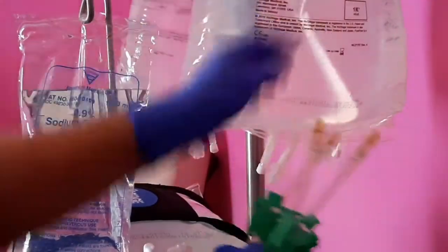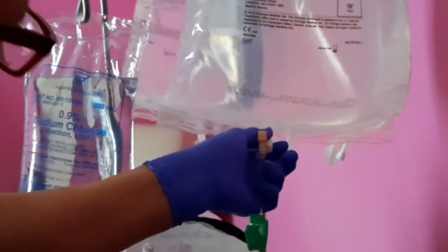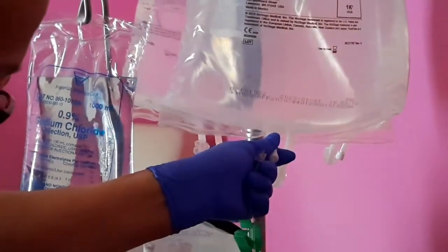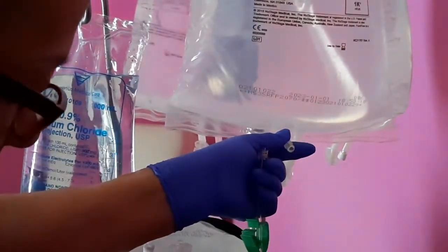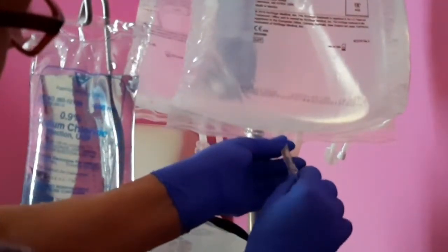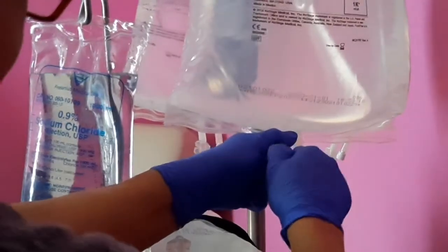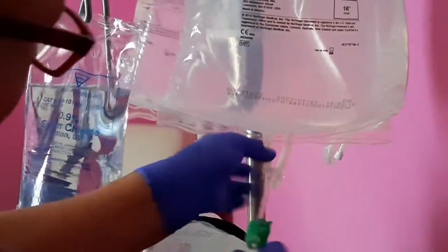Here, so I'm going to use this one. This is the first one. So what we're going to do is remove the cap off of that line and the white cap off of one of the ports here, the one on the left, and screw that in there and make sure it's nice and tight. Then we're going to clamp. That's for safety.